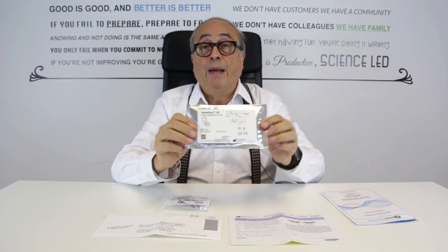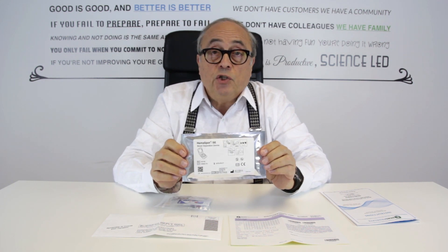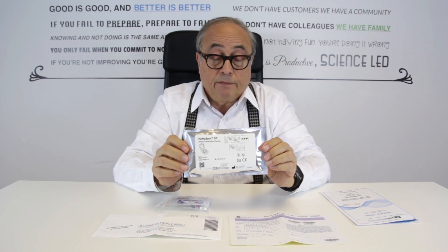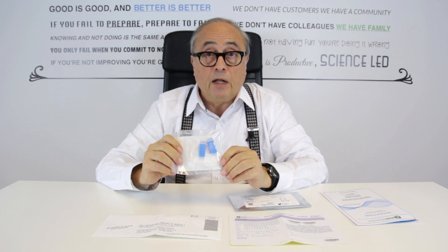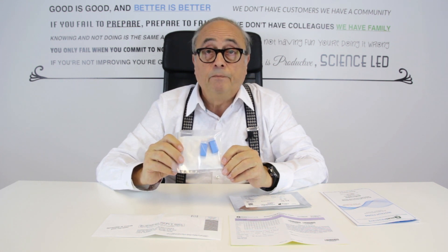You get a foil package which contains your blood collection device, and you get another package which contains two lancets — one is a spare — plus you receive an alcohol swab, a bandage and some gauze.